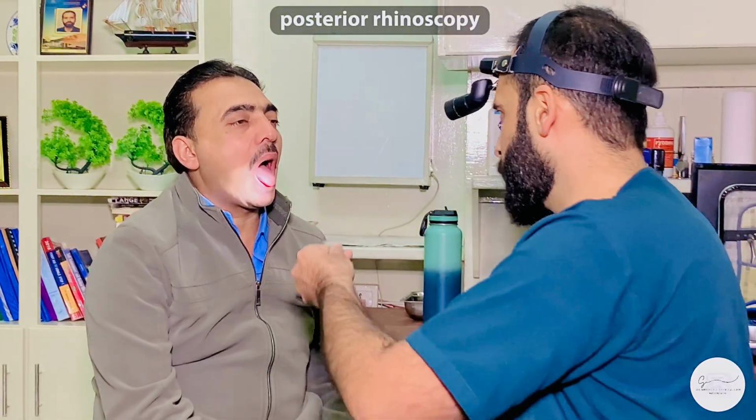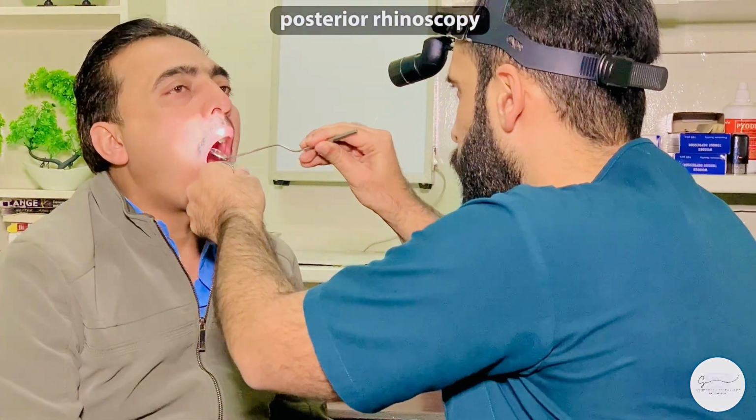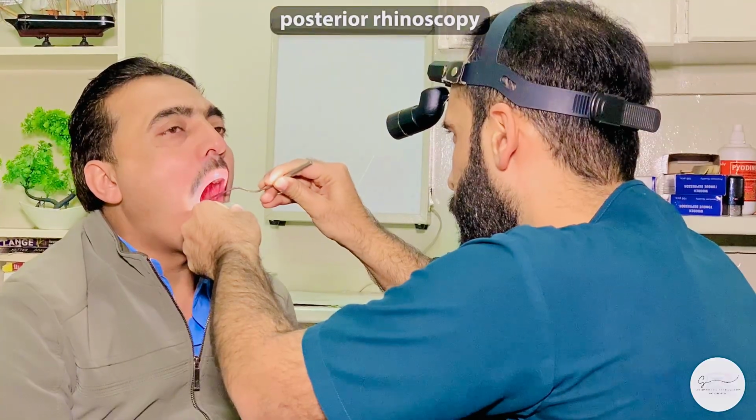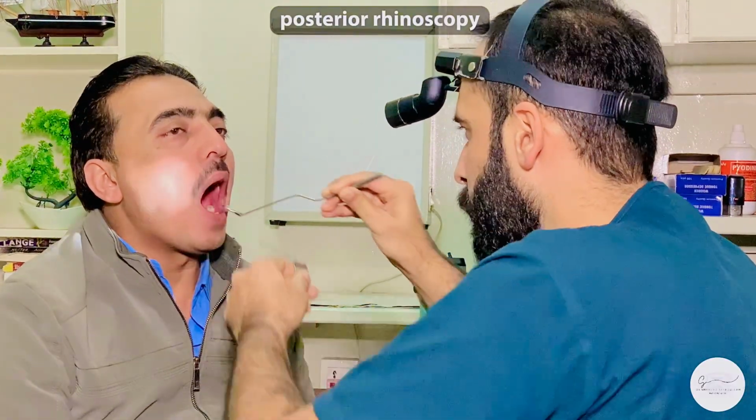You will take the tongue depressor in the left hand, gently depress the tongue and introduce the posterior rhinoscopy mirror gently in order to have a look at the nasopharynx or the postnasal space. You should not be touching the posterior wall as to not elicit the gag reflex.